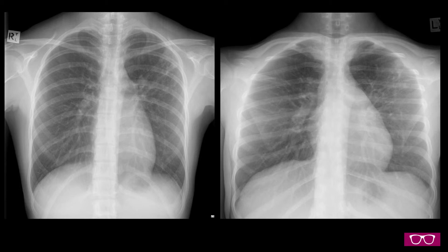These are PA and apical lordotic chest radiographs in a 25-year-old female patient who presents with cough. There are nodular opacities at the left lung apex, which extend towards the hilum, where there is an area of confluence and possible cavitation, characterised by central lucency.